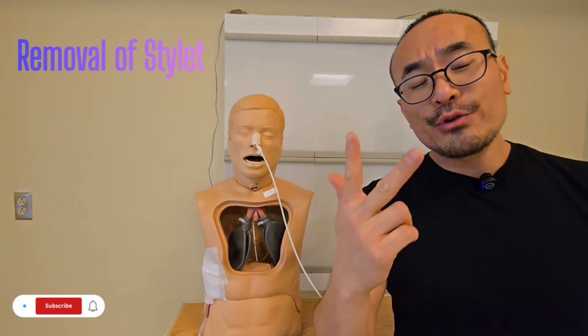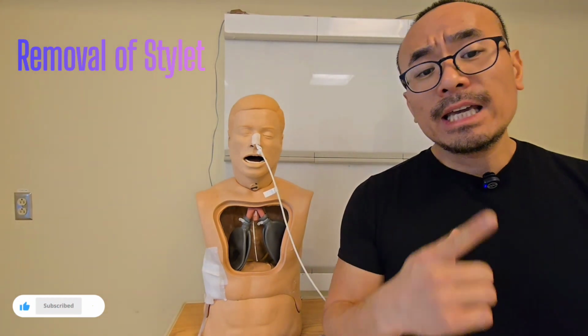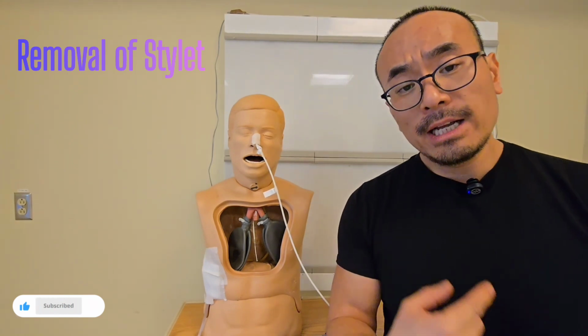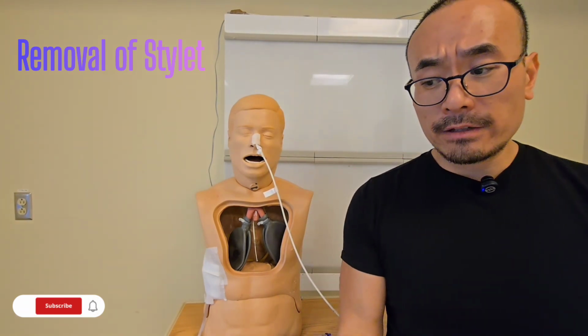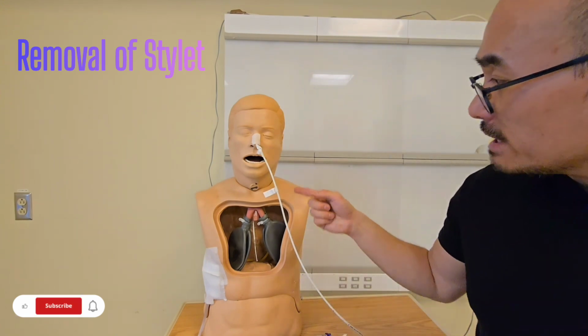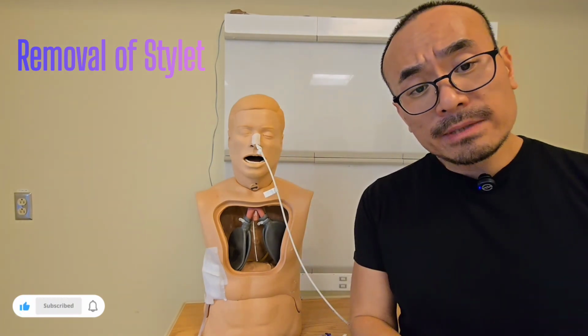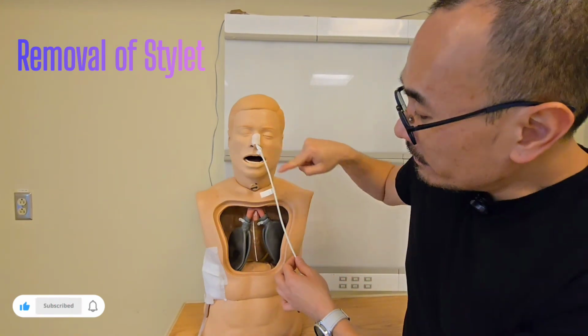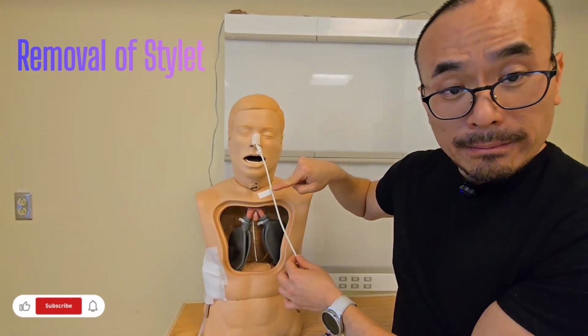All right, so now your X-ray has been done. It has been confirmed that it is in place by the physician or the nurse practitioner, and there's an order for you to start your feed, and it's okay to do so. For these patients, now that we have confirmed that it is in place and is good to go, we are going to advance it until the second part here.